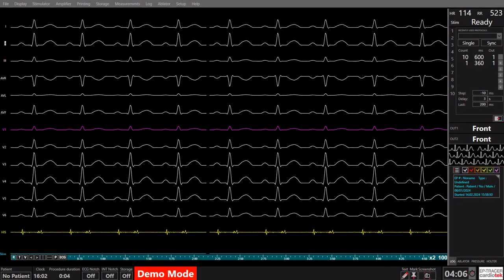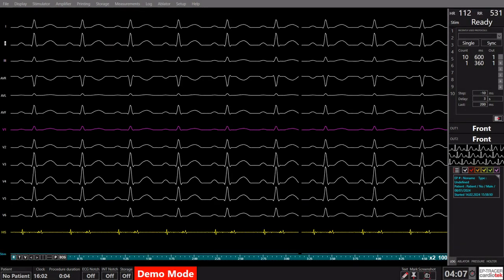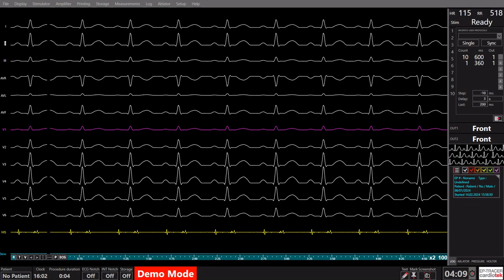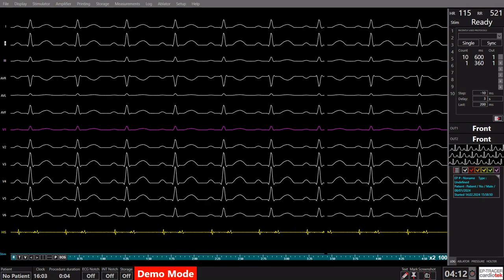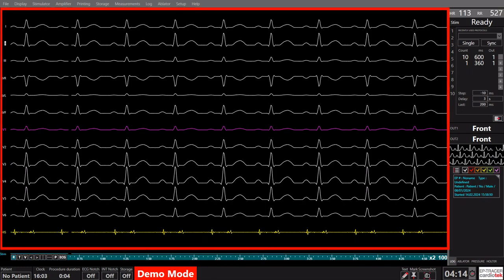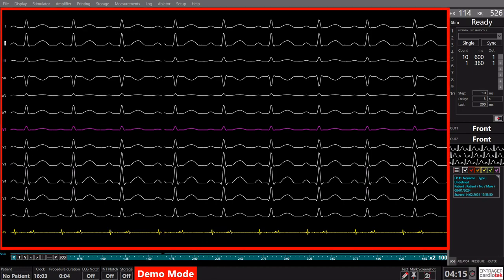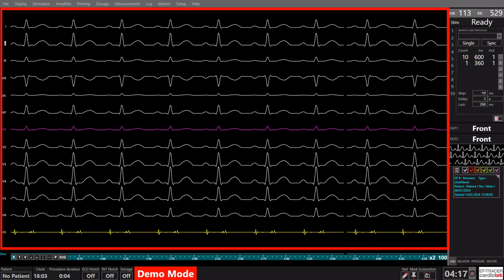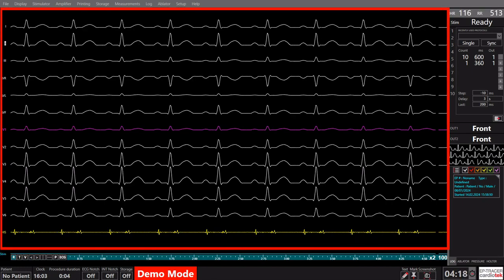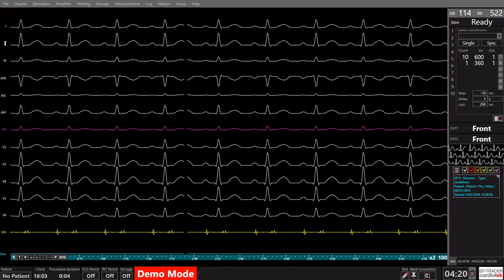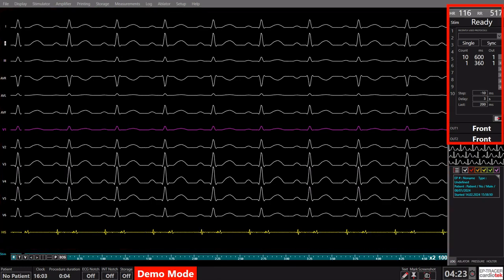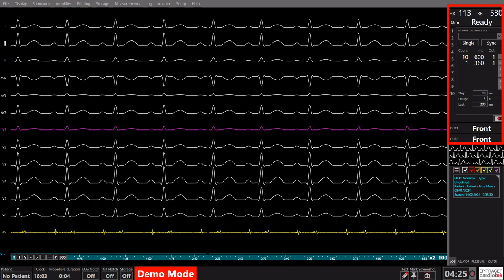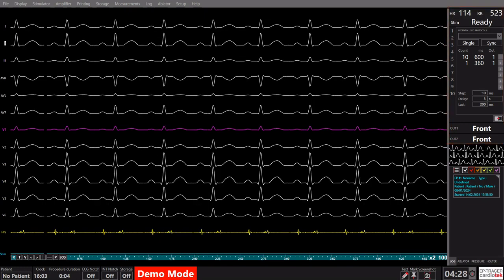Welcome to the primary interface of the EP Tracer software. In this central hub, you can effortlessly locate the signals at the center of the screen, ensuring a clear focus on crucial data. To the right, you'll find intuitive controls for the stimulator, offering convenient access and efficient management.